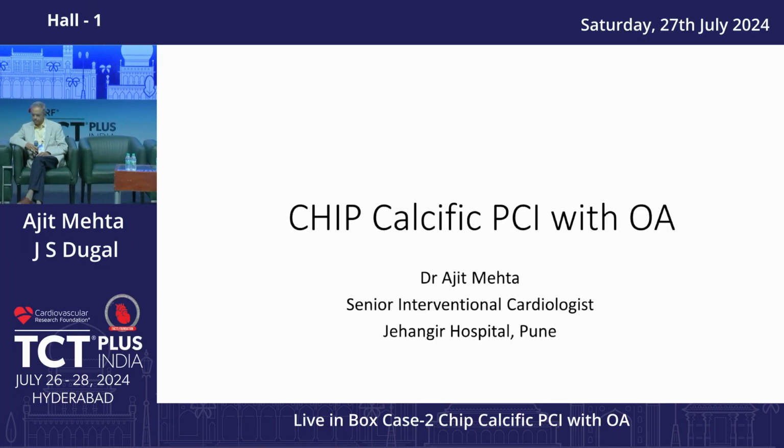I am Dr. Ajit Mehta from Jahangir Hospital, Pune. So we have a very interesting case: calcific coronary artery disease, left main bifurcation, and calcium modification technique under intravascular imaging.